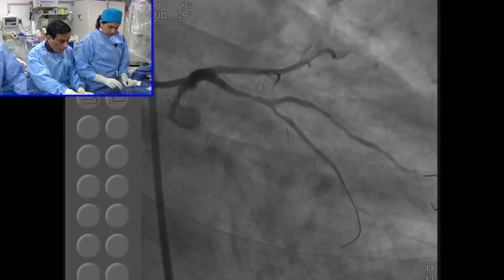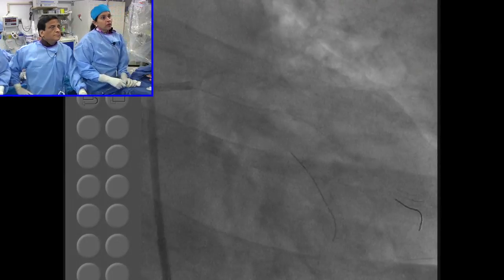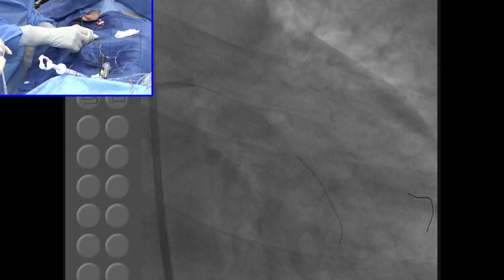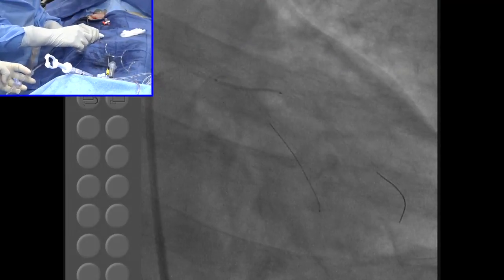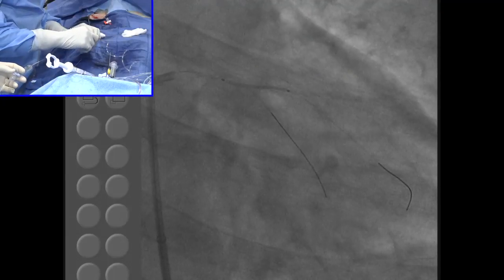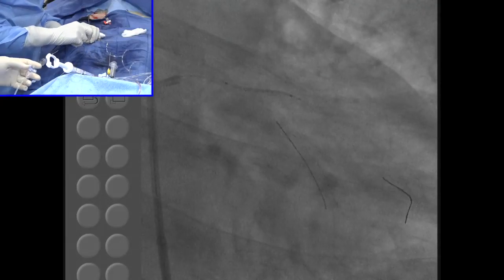The patient has a Promus in the right coronary. I thought that could have easily taken a 2.5. No. It's a lot of disease. Diffuse disease. But I mean, if necessary, we can post dilate, no big issue. Samin, very provocative. Okay, here is the challenge. Didn't think about this, and that's your explanation. Whether we call it a simple bifurcation or a complex one, here it is.